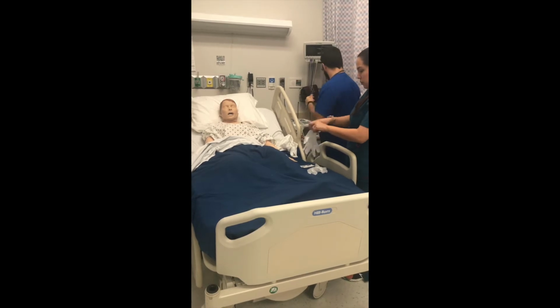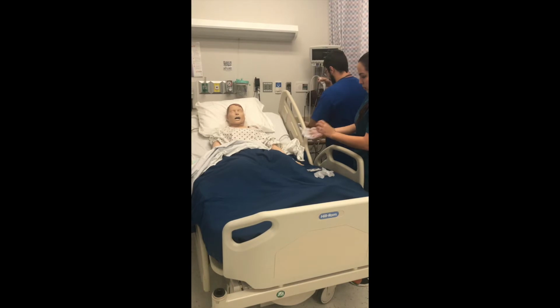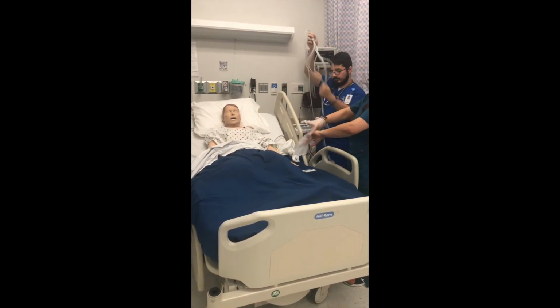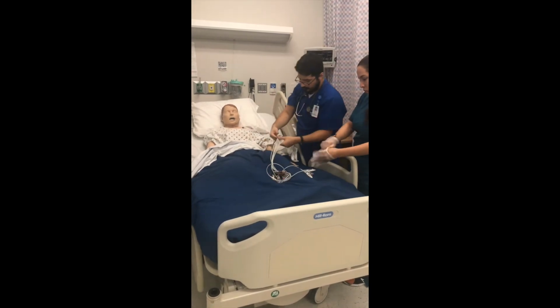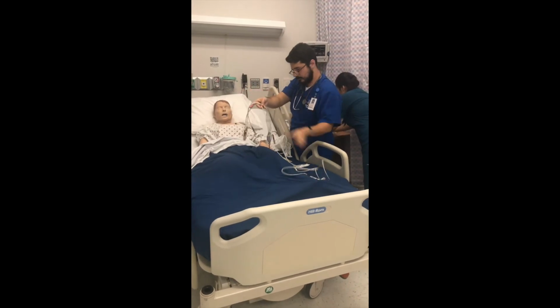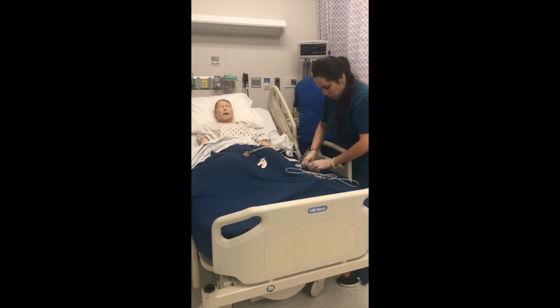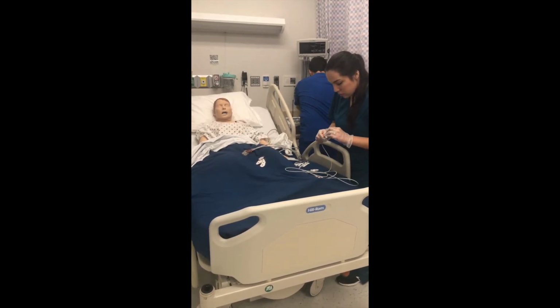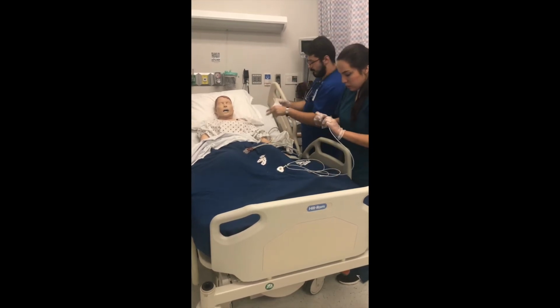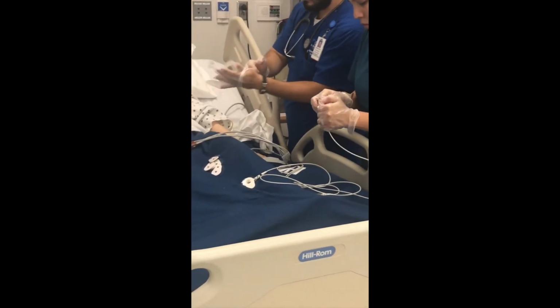We're going to also attach leads to the patient's chest. In this process, we will assess chest for placement of electrodes. We're going to determine if skin site care is necessary. If so, we're going to cleanse areas with a skin prep pad or alcohol swab, or clip hair if needed. We're also going to allow the area to dry thoroughly before placing electrodes. We will attach lead wires to electrodes before pressing onto the patient's chest. The rationale is that this prevents excess pressure, especially after open heart surgery or chest trauma.